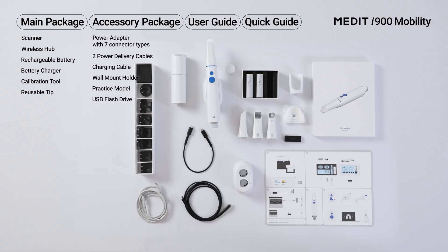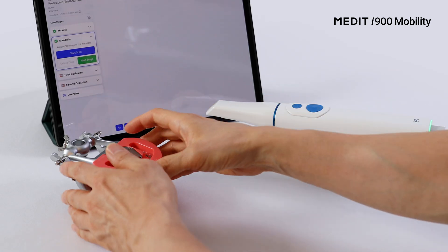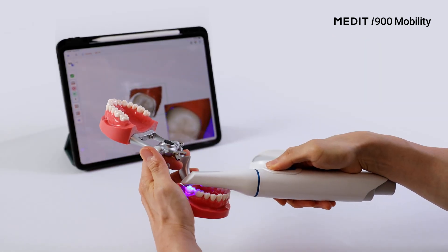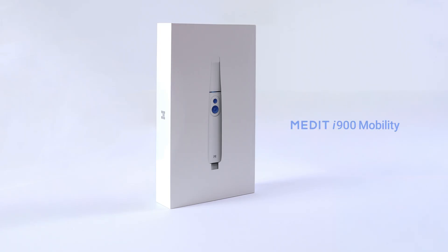Experience a simple setup, a complete package, and ultimate convenience. You can try it out anytime, so why not now? That's the unboxing of the i900 Mobility. Thank you.